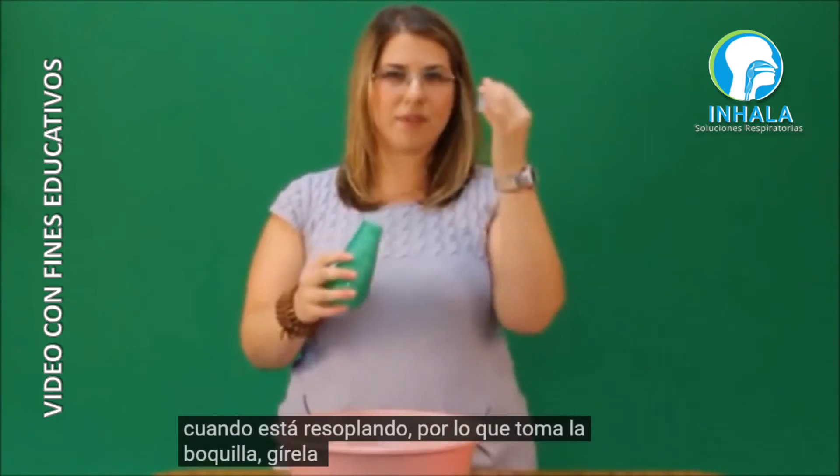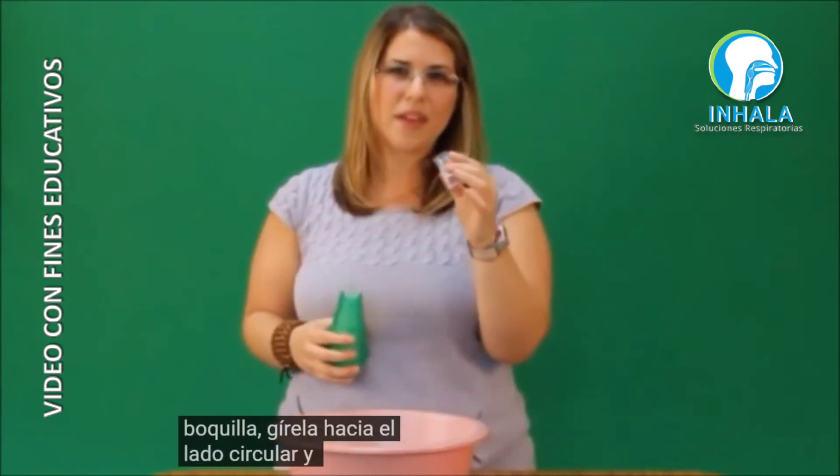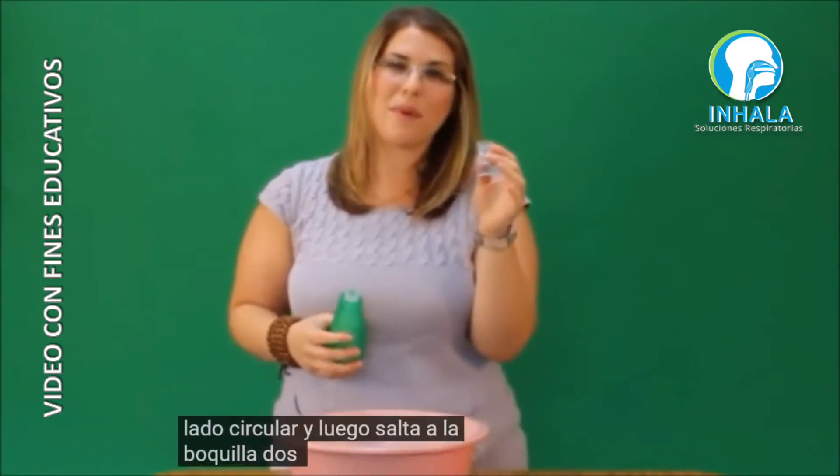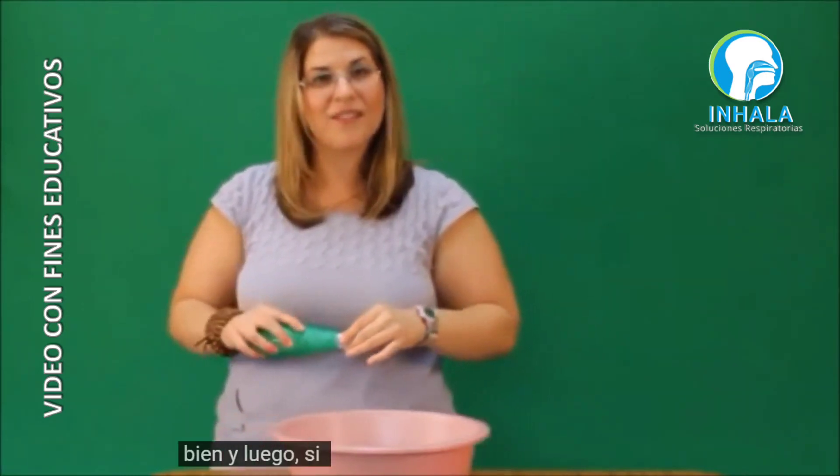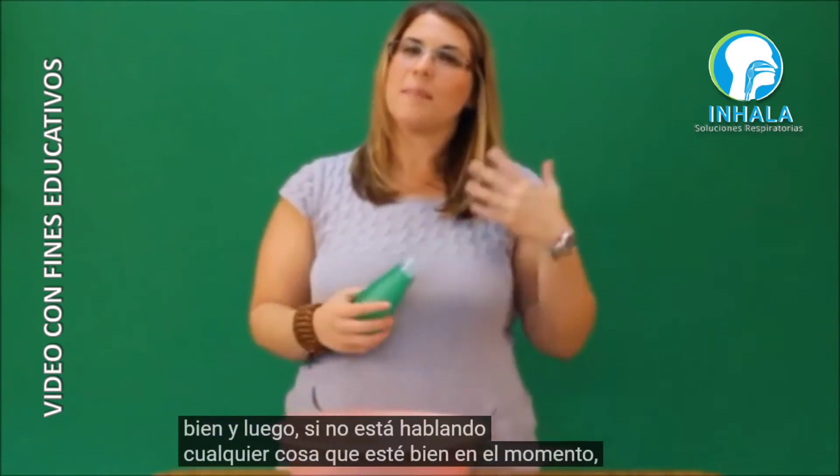You can also use the mouthpiece to help open up the throat when you're huffing. Take the mouthpiece, flip it around to the circular side, and then huff into the mouthpiece two to three times.